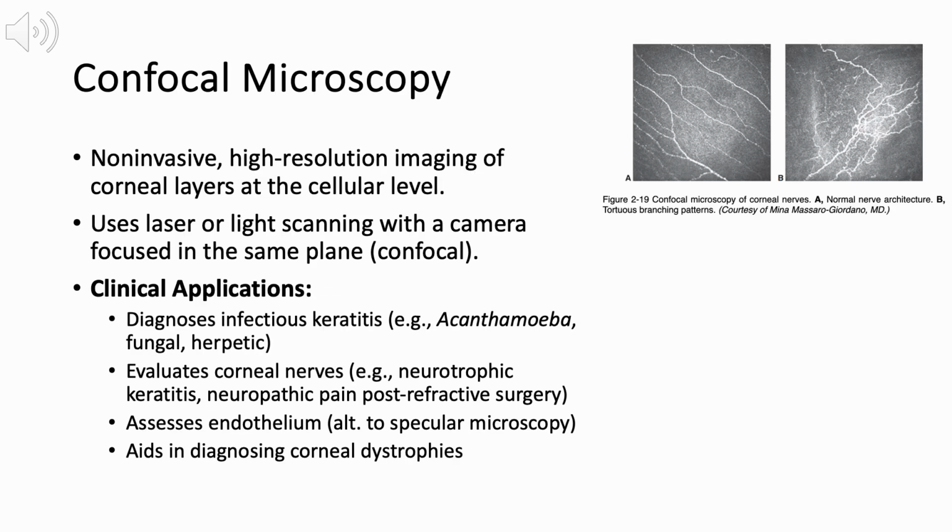Confocal microscopy is a non-invasive, high-resolution imaging technique that provides cellular-level views of the corneal layers. It works by using a laser or light source in conjunction with a camera focused in the same optical plane, allowing for sharply focused cross-sectional images of corneal microstructure.